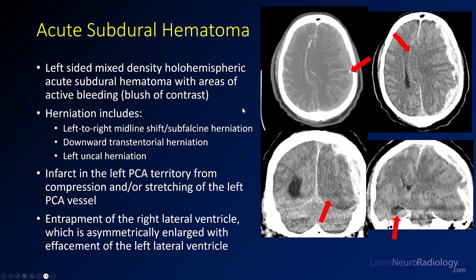This is an acute subdural hematoma crossing essentially the entire hemisphere. On CTA, there is a small area of active blush indicating active hemorrhage, which is a risk factor for poor prognosis. There's significant herniation, midline shift, and uncal herniation, and the left PCA territory infarct results from compression or stretching of that artery. The right lateral ventricle is a little enlarged because CSF is still being produced but the foramen of Monro is obstructed by mass effect, causing hydrocephalus on the contralateral side despite the compression elsewhere.